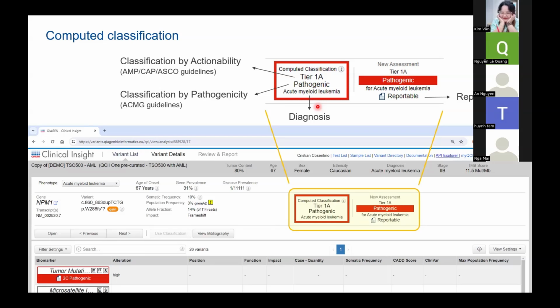1% means out of 100 cells, one cell has that cancer mutation. So our assay should be sensitive enough to detect that. That's where we recommend you run some positive control samples first for the assay validation, and have those mutations. There are some companies, like Horizon and others, which provide cancer samples with known mutations at particular allele frequencies.